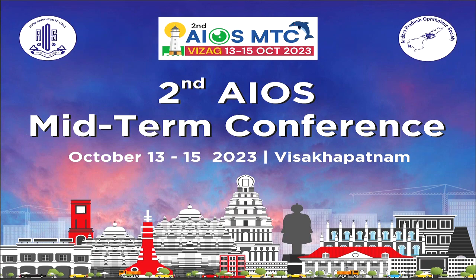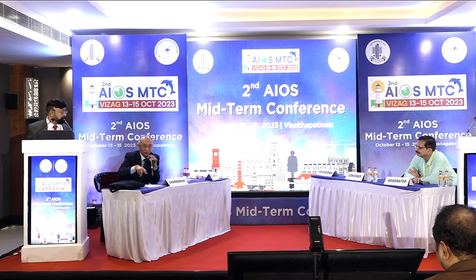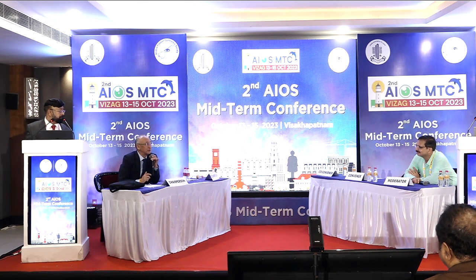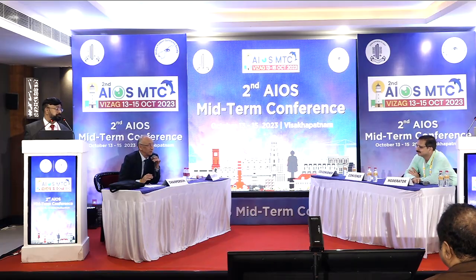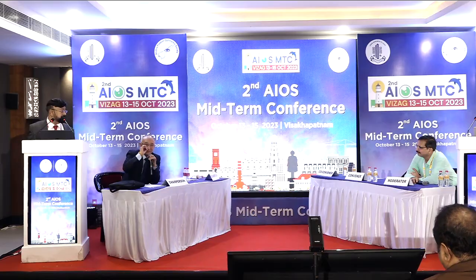That was a fantastic video I've seen, an innovation by somebody. Maybe it will come to market very soon, where you have both the eyelets inside. First it goes like this, then with the second hand, it goes inside. So those preloading devices can sometimes be better, especially in a large subluxation, shallow chamber, or upthrust. Things can be managed very effectively.